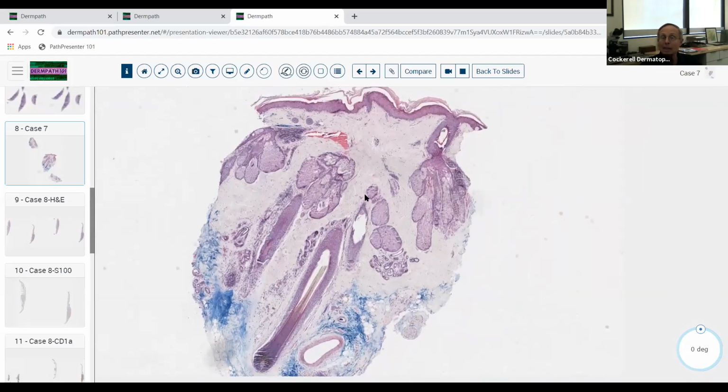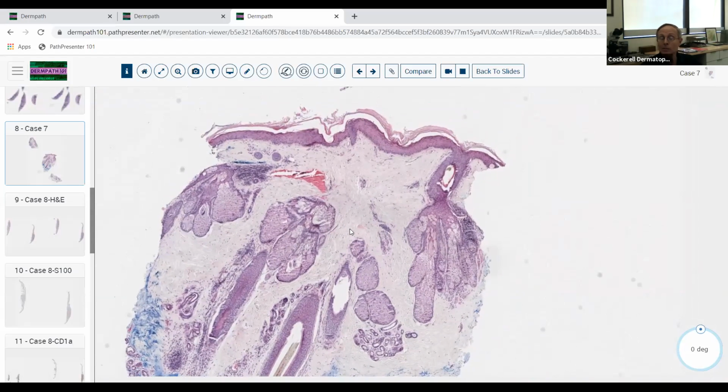And this patient in this case actually happened to have dermatomyositis. They had elevated muscle enzymes, they had classic features of dermatomyositis, and they developed this lymphocytic infiltrate with this acute alopecia. So if you thought AA in a background setting of androgenetic alopecia, that's perfectly reasonable. I hope you did think that. If you just thought it was maybe a weird androgenetic alopecia with more lymphocytic infiltrate, that's okay too.